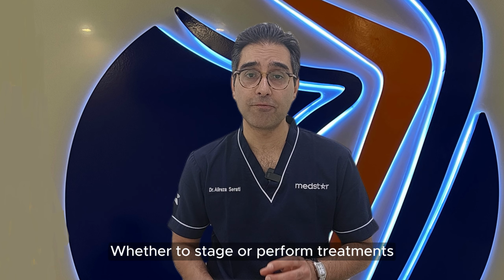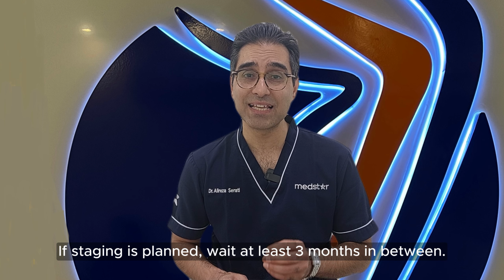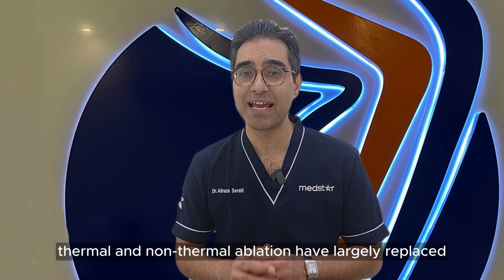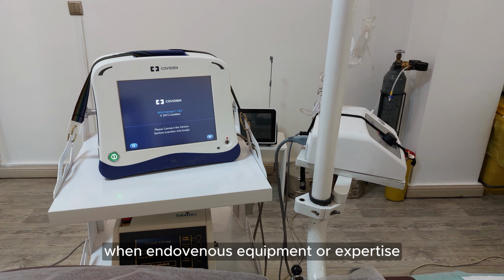Whether to stage or perform treatments concomitantly depends on the patient and physician. If staging is planned, wait at least 3 months in between. While endovenous thermal and non-thermal ablation have largely replaced open surgery, ligation strategy can still be applied when endovenous equipment or expertise is unavailable.